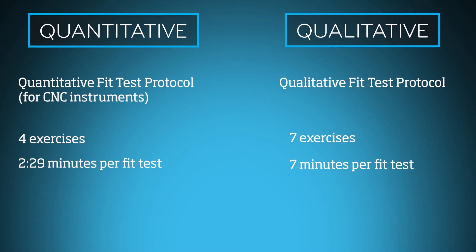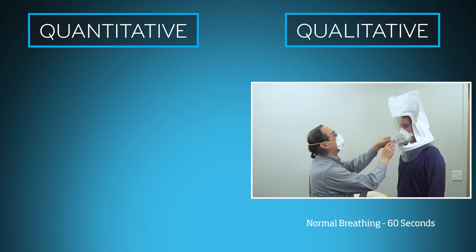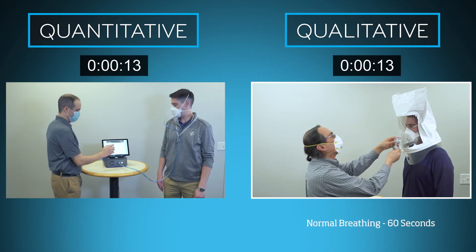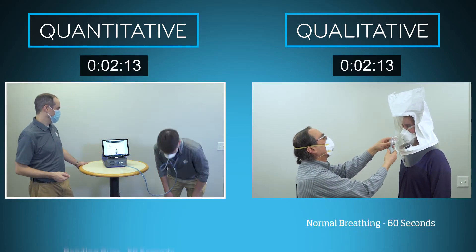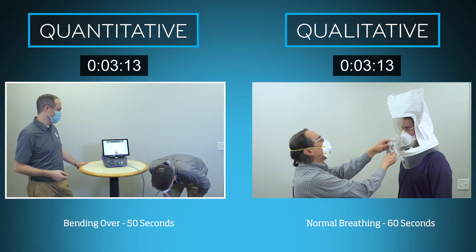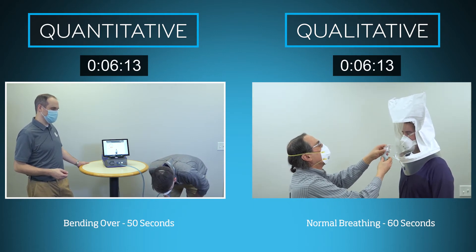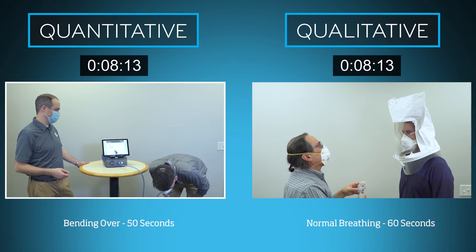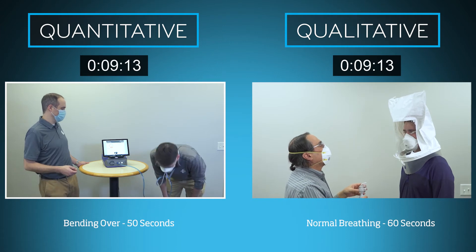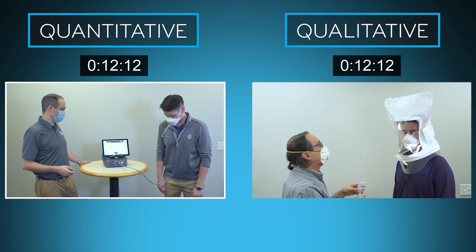Let's see how these two fit testing methods compare. For the qualitative testing method, the fit test starts with 60 seconds of normal breathing. For the quantitative method using the PortaCount fit tester, the fit test starts with 50 seconds of bending over and returning to an upright position, taking two breaths at each extreme.